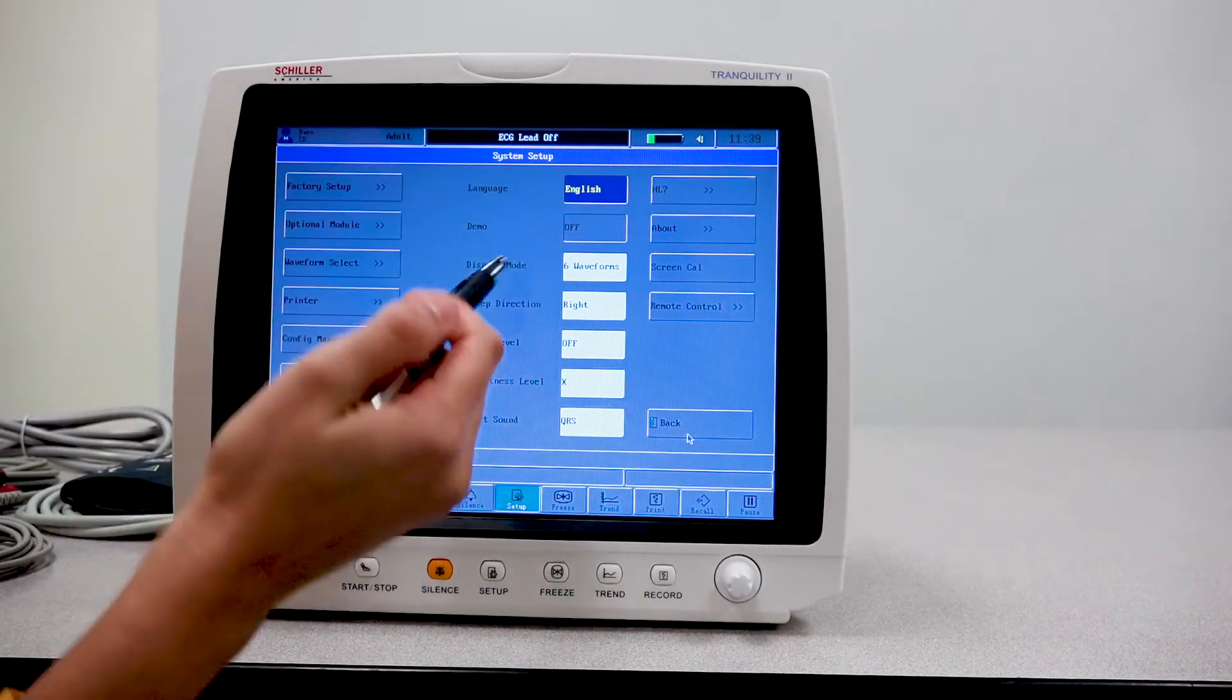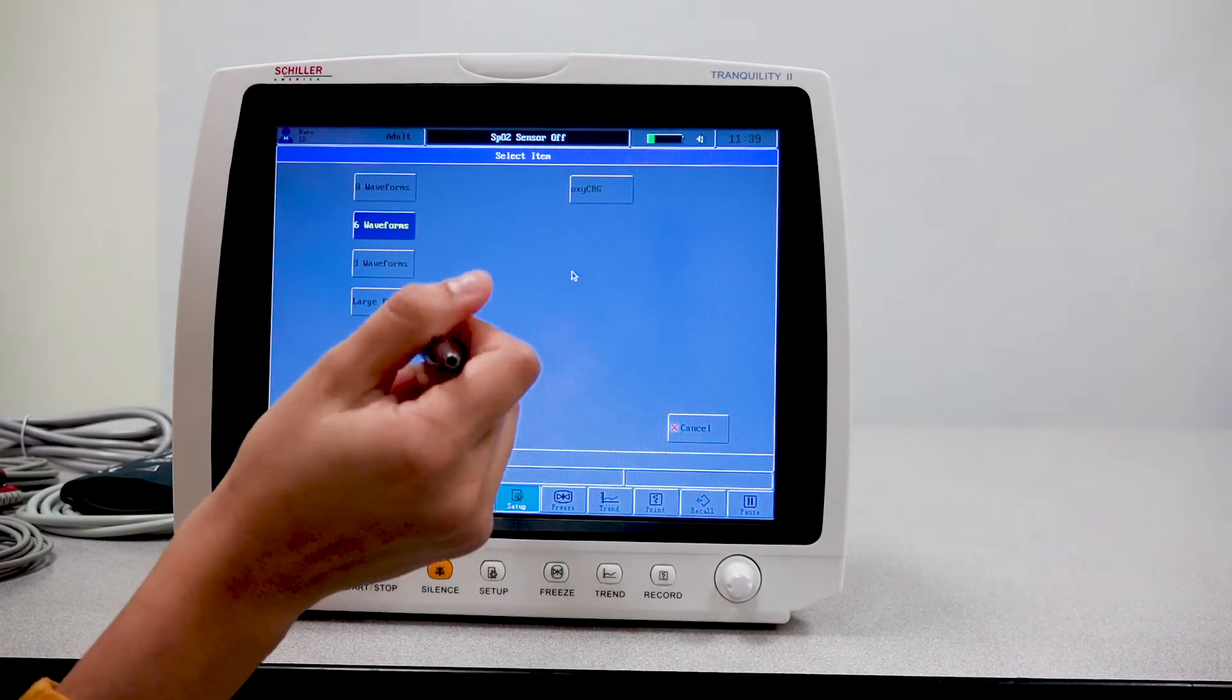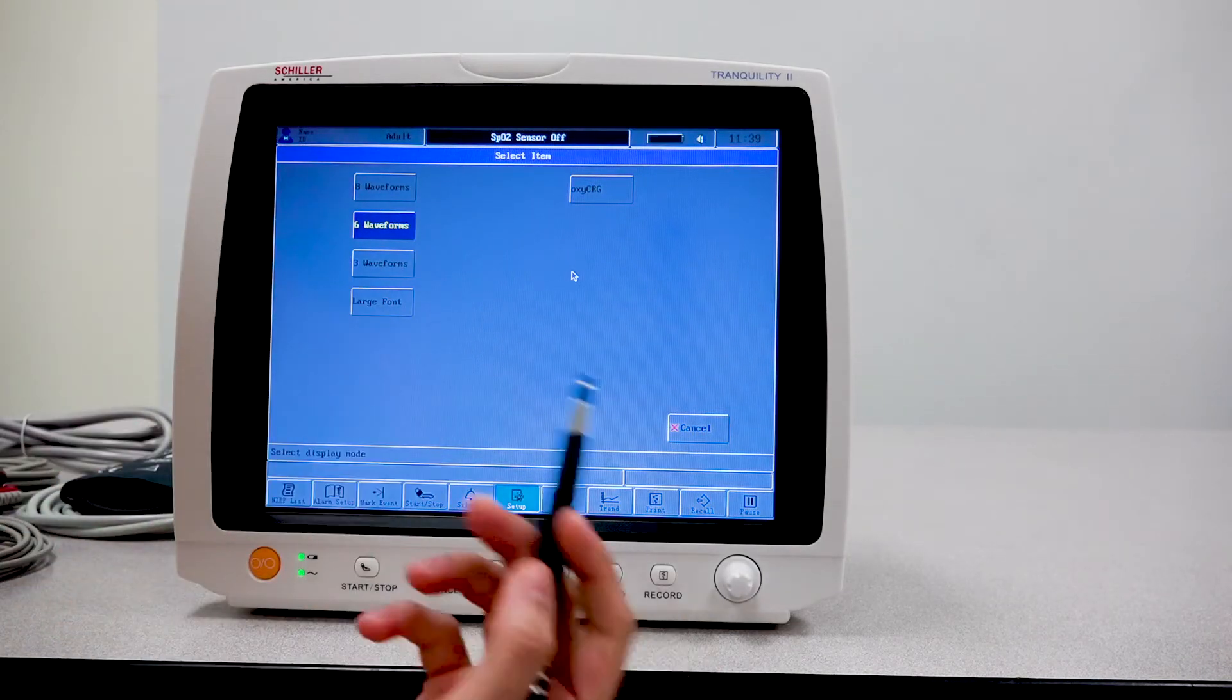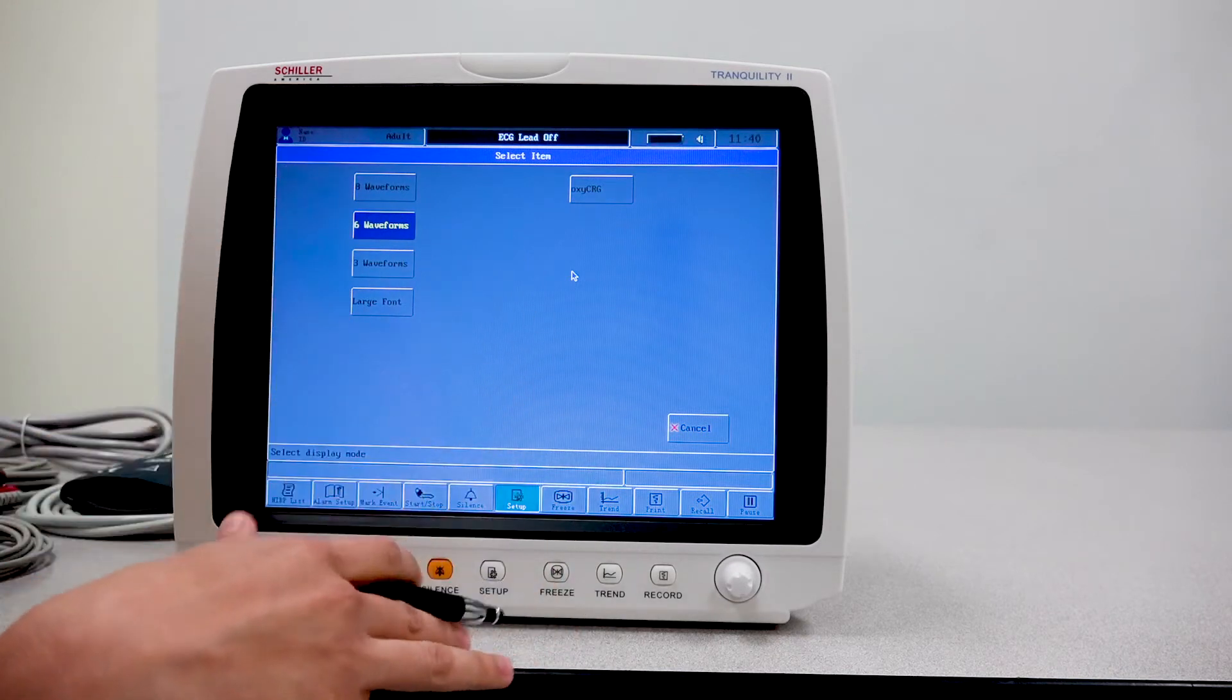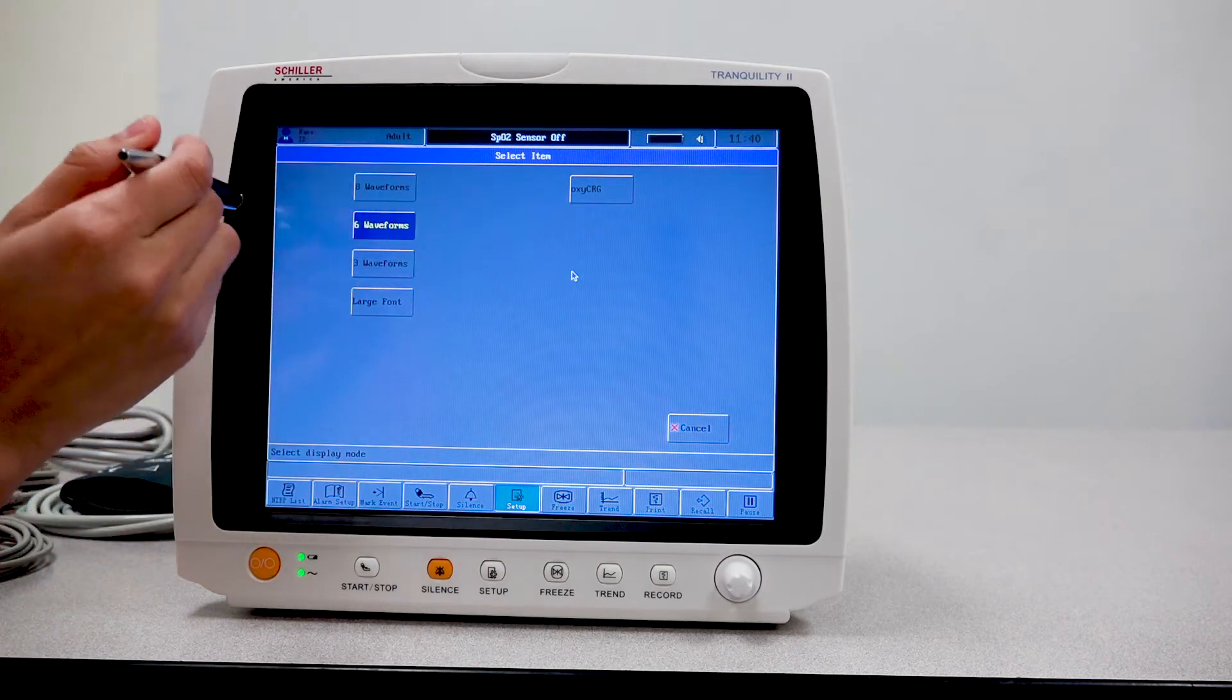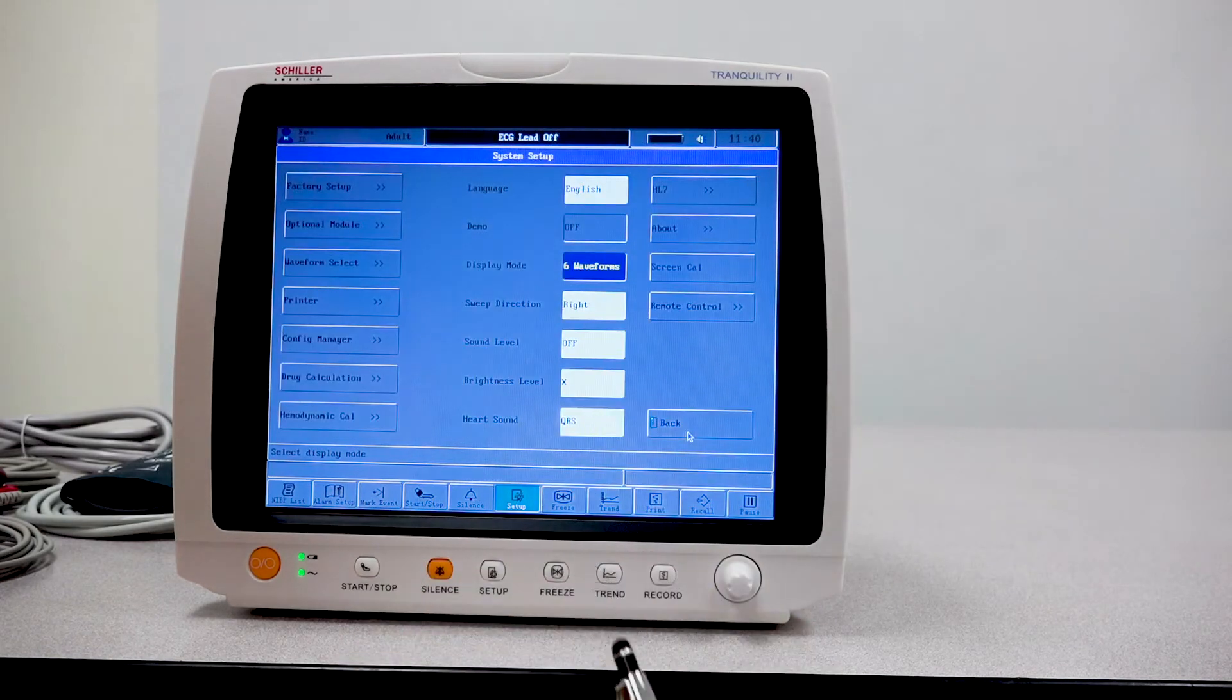You also have here the options to change the amount of waveforms that you see on the screen. By default, once powering up the unit, the unit will show six waveforms. You can change that to three waveforms or eight waveforms, depending on what the nurse or the doctor would like to see.